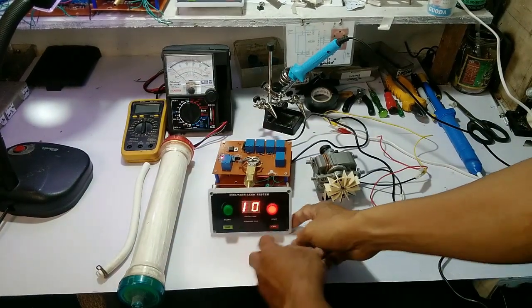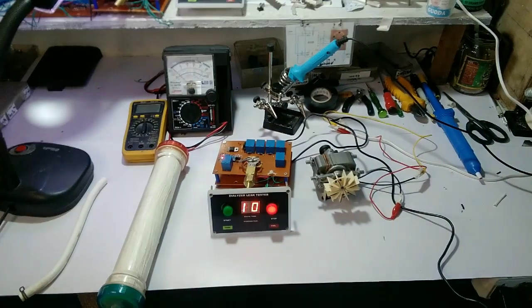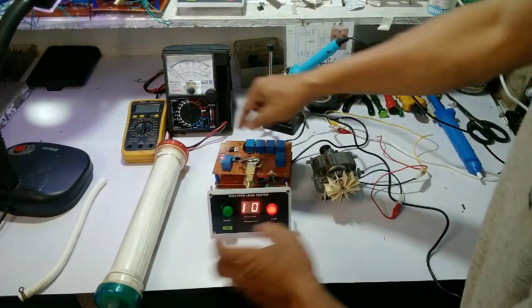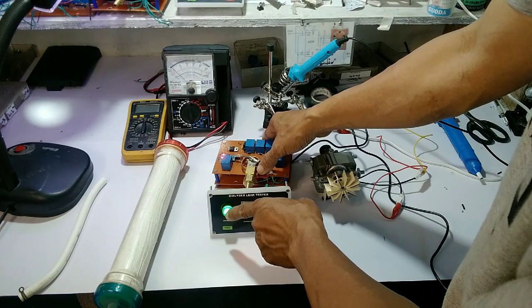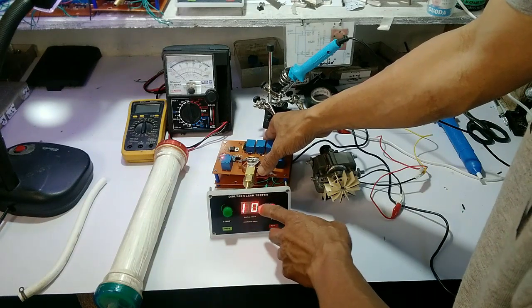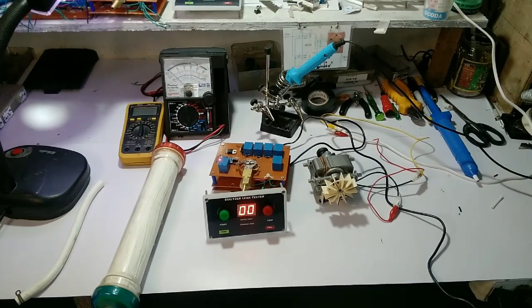Yan po yung ginagamit sa dialysis para sa mga kidney patients. Ang main purpose po ng dialyzer leak tester ay para malaman ang integrity ng dialyzer — kung pwede pa siyang gamitin o hindi na. Once ng dialyzer ay natest, kung walang leak, ibig sabihin walang hangin na sumisingaw sa loob.